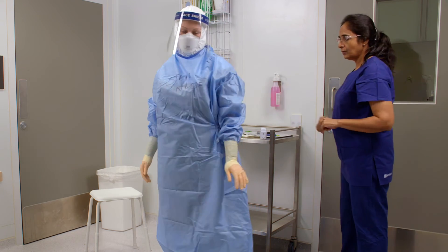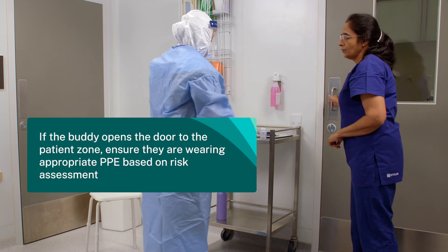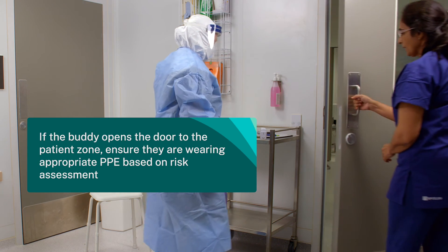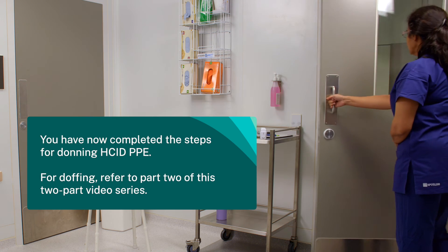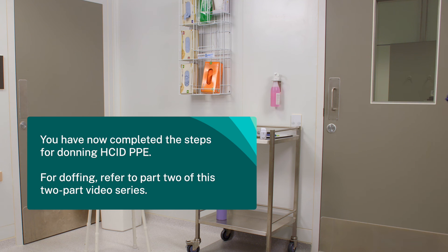The health worker is ready to enter the room. Ensure you do not contaminate the gloves as you enter. You have now completed the steps for donning HCID PPE. For doffing, refer to part two of this two-part video series.